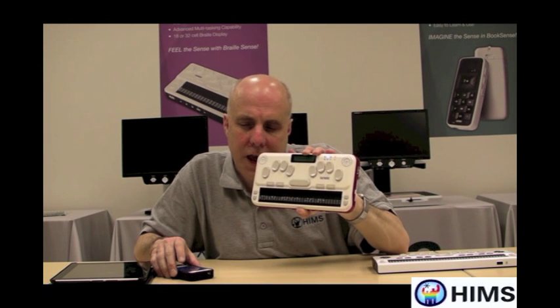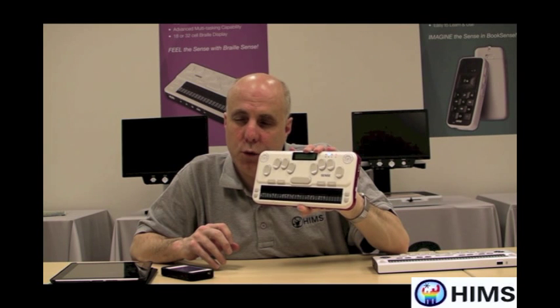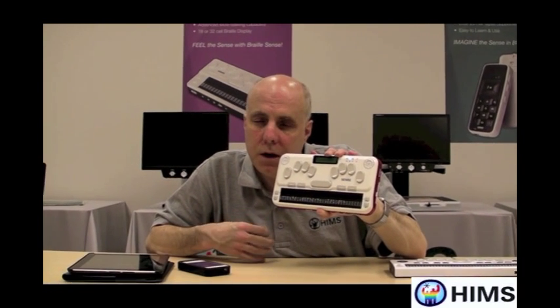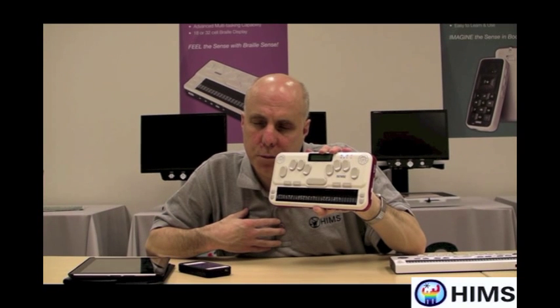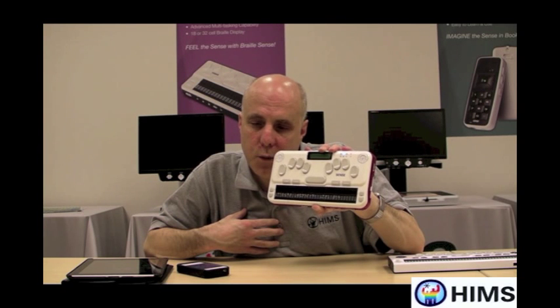So that is how you do the connection. Once that connection is made, you actually don't have to worry about doing it again. I also didn't mention that the PIN I used was 0000, but you're welcome to use any PIN that you're comfortable with, as long as you re-enter it on the BrailleSense U2 the same way.